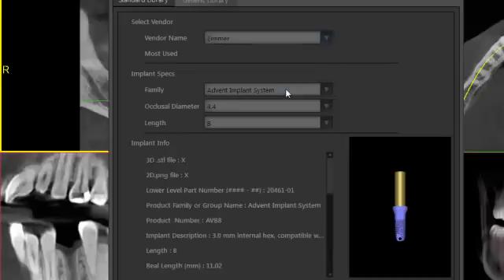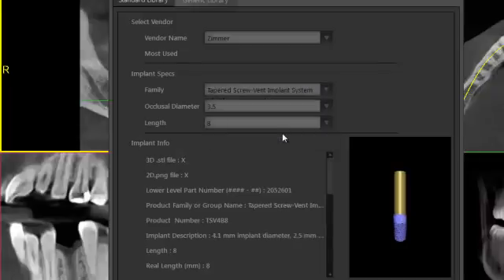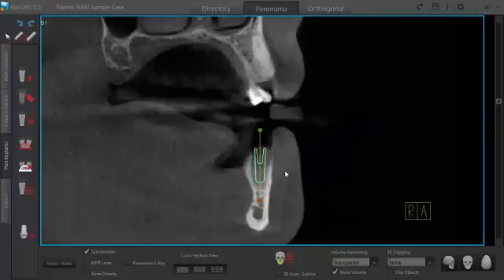I'm going to drop down to Zimmer and use the tapered screw vent implant for this particular case.